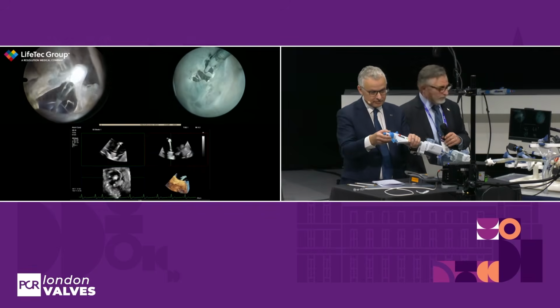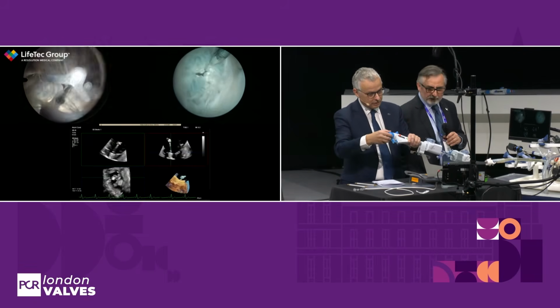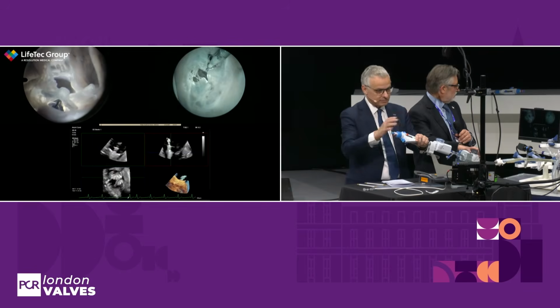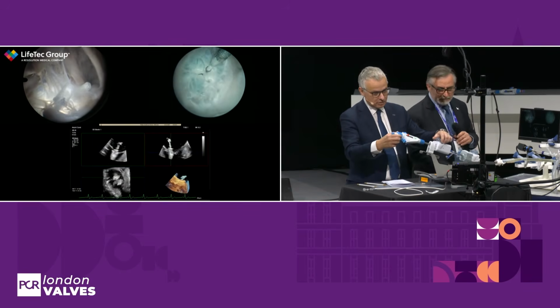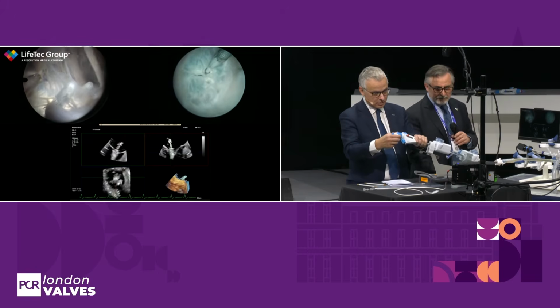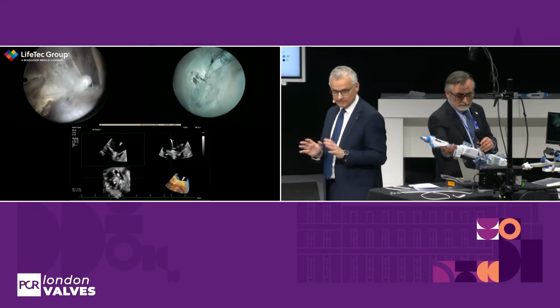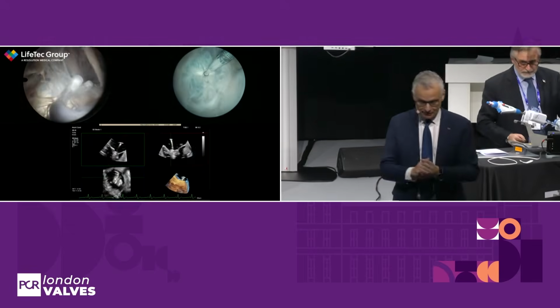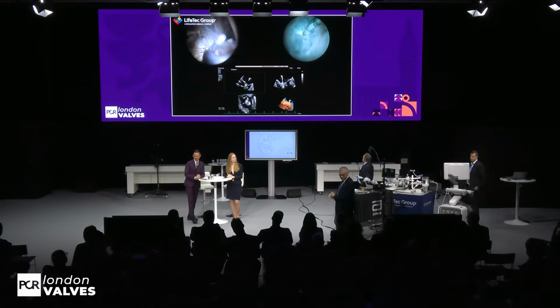We can go here, open a clip, find the chordal free zone, which is this one, pull, drop grippers, and this will be... And you see how nicely coaptation is better. The patient is happy, family is happy.